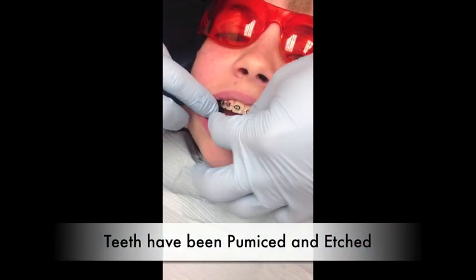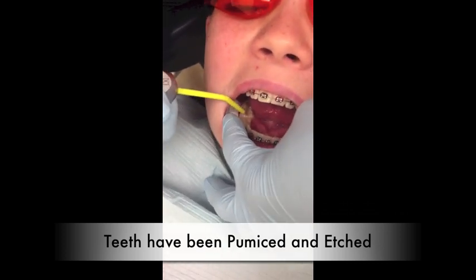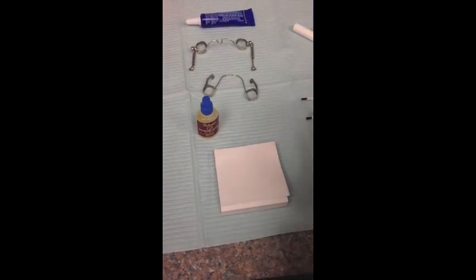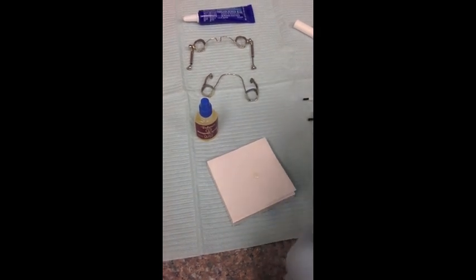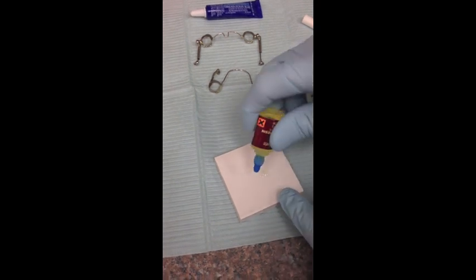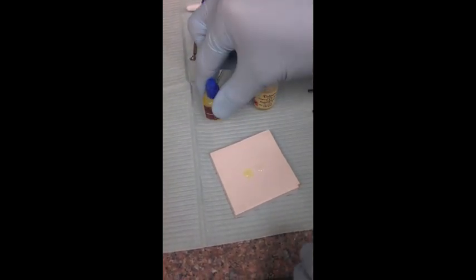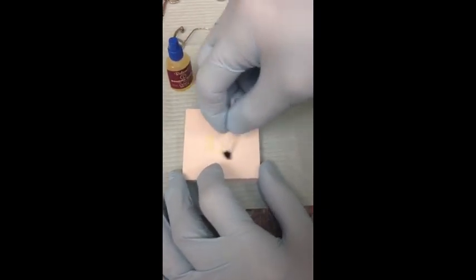You can probably start mixing that up. You have to seal the teeth with the sealant — it's a Part A, Part B. You put a drop of each, equal parts A and B, and then you mix them together. Once you start the mix they start to set, so I'm not going to mix it until he's ready. You mix them together, get a good mix, and then he's got to seal the teeth with this.